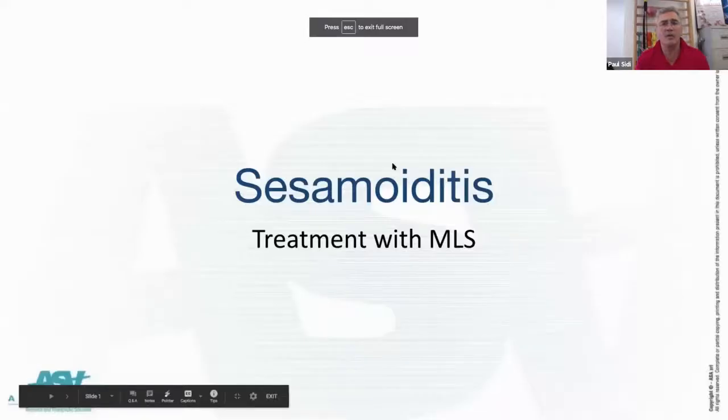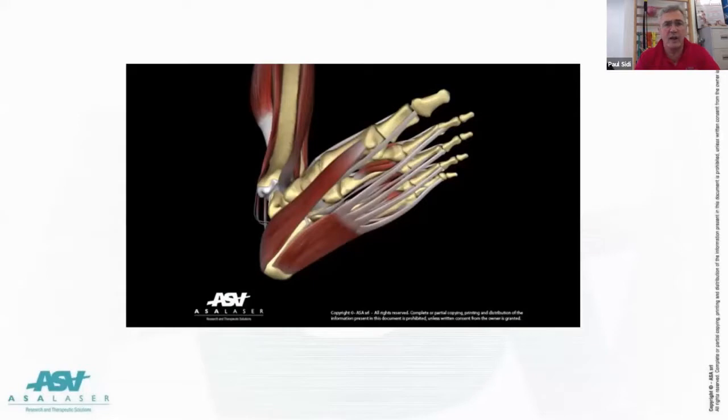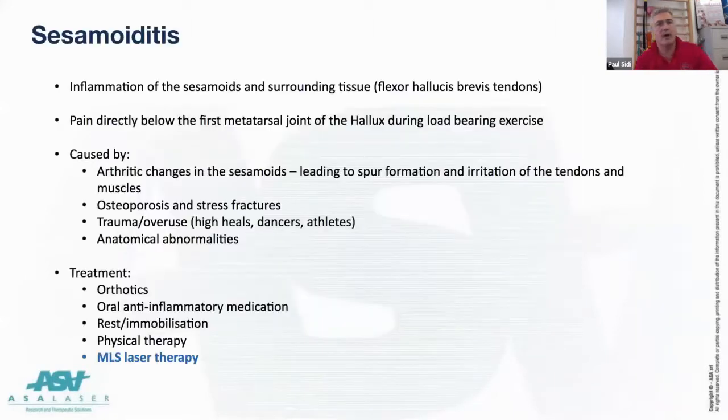Here we go: sesamoiditis, treatment with MLS. Again, treat that name with a little bit of care, because there's usually a lot of degeneration in there. Here's a lovely picture of the foot. This would probably move if I had the right software in here, and it'd show you what pressure they go under around this area. These are embedded in the flexor hallucis brevis, which is under a lot of pressure when we take a step forward.